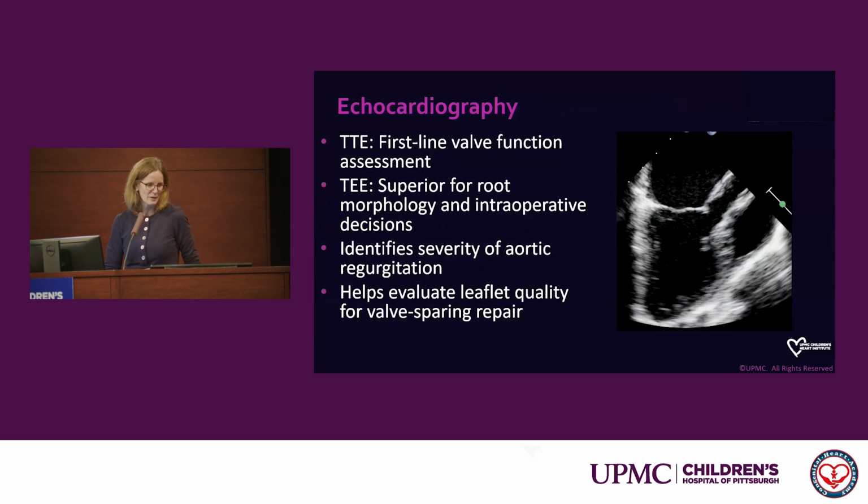And then I would put TEE. Sometimes I think of this as an advanced imaging modality. This is covered beautifully by Dr. Lanford. But certainly I think a lot of additional information can be gathered here when you're thinking about aortic valve, aortic root, surgical issues, like leaflet morphology, coaptation defects, just like Dr. Lanford beautifully pointed out. And this is especially salient if there's operative disease and surgeons are thinking about repairing, which is an unusual circumstance, but if you're in that circumstance, this is the modality you want.